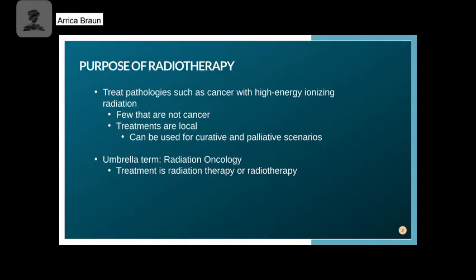The purpose of radiotherapy is going to be treating pathologies, typically that's cancer, with high energy ionizing radiation. The ionizing radiation is very similar to X-rays. We have just used an accelerator to create a higher energy version of it. There are a few pathologies that we do treat that are not cancerous. I won't explain those too in depth right now, but there are some things where a mass that's not cancerous could be putting pressure on the spinal cord, and we have to go in and use ionizing radiation to see if we can help shrink that tumor to relieve the pressure on the spinal cord.